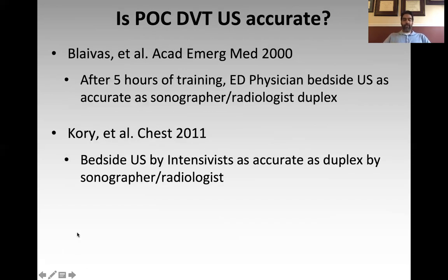So are we good at this as intensivists, as clinicians? Well, there have been a number of studies. These two studies, the first one in the ED setting, the second one in the medical critical care setting, showed that with some concentrated training, both didactic and hands-on training, ED physicians and intensivists can be as accurate as sonographers and radiologists in picking up lower extremity DVT in the ICU setting or in the ED setting.